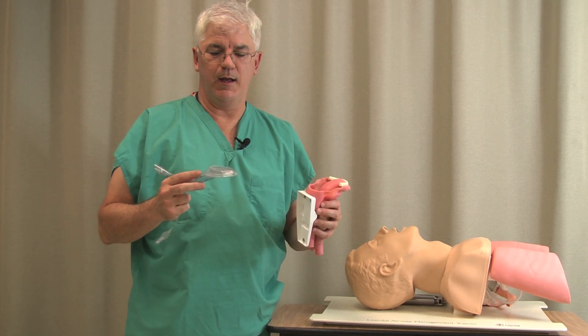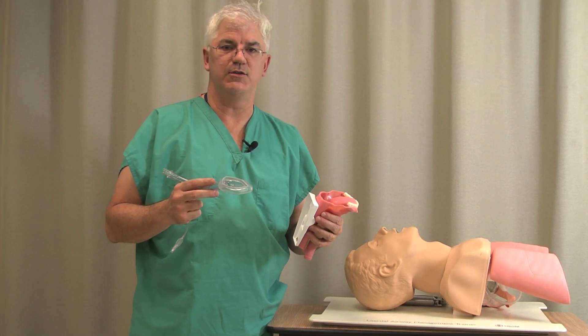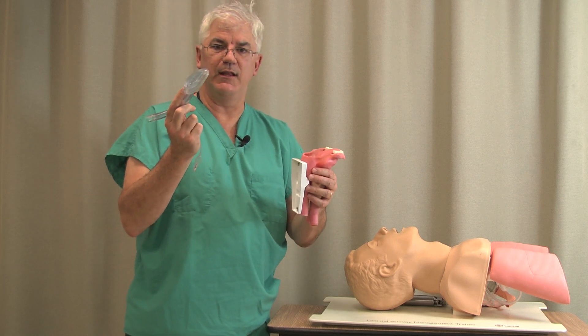This is use of the LMA, and this is being done for the MICU airway course. Let's talk a little bit about the LMA.